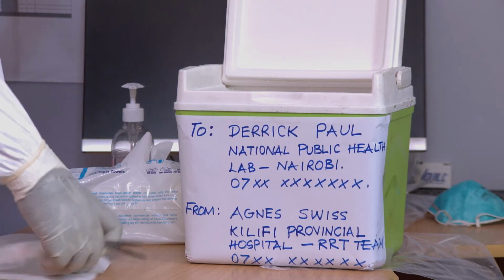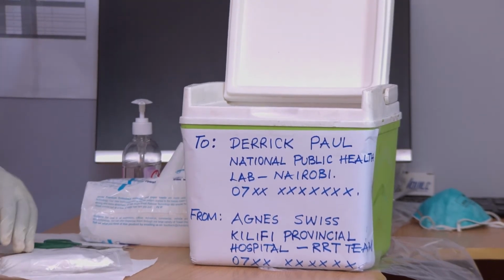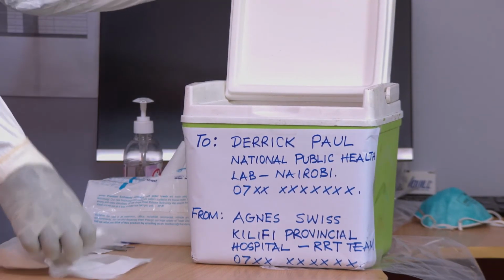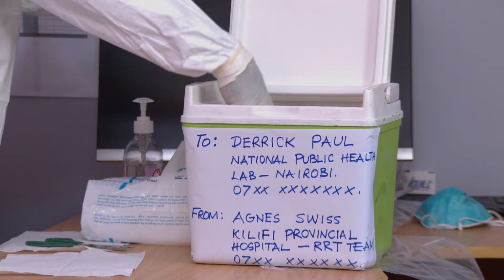Put the collected samples, the NP and OP swabs, inside the cool box. Label the cryovial with the name of the health facility, the patient's ID, and date collected.